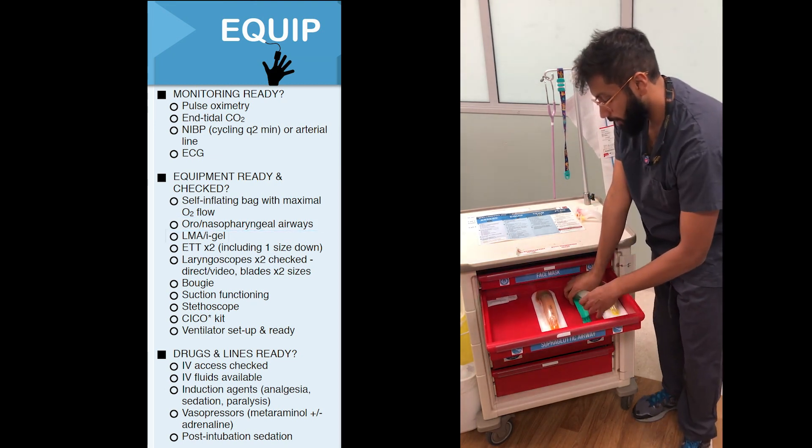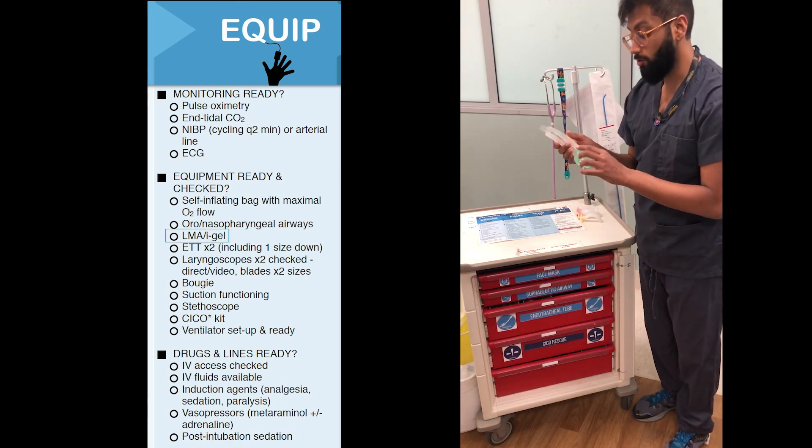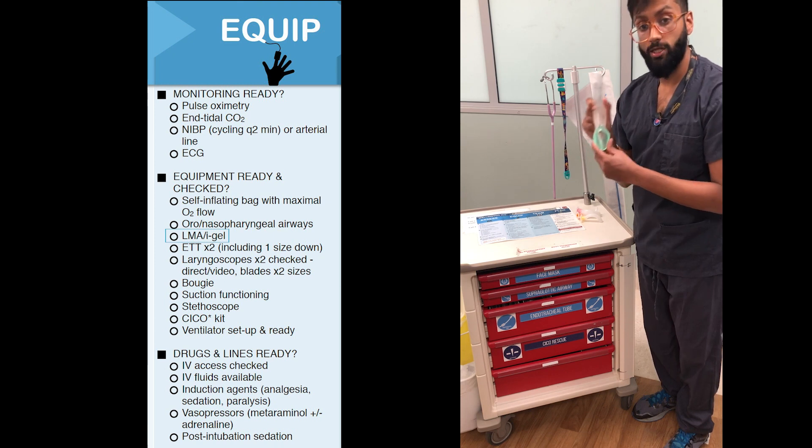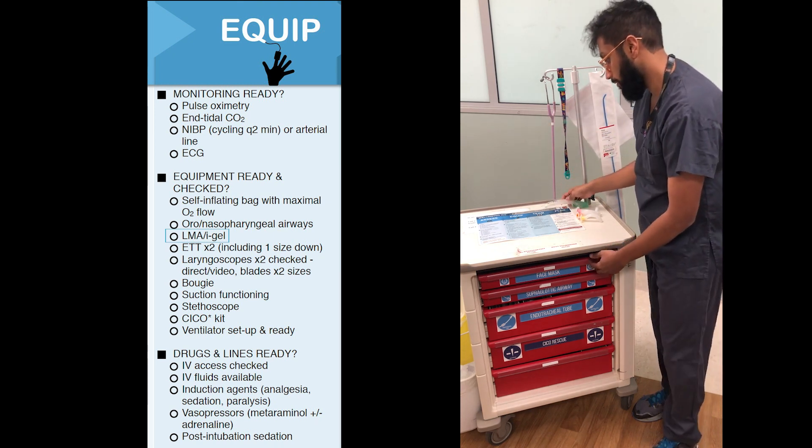In the next drawer you'll find an iGel or an LMA. A laryngeal mask airway — this one's called an iGel — is a really important rescue measure for getting oxygen into your patient if you can't pass an ET tube down.